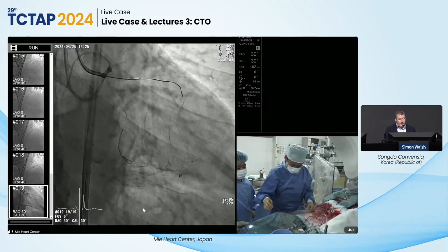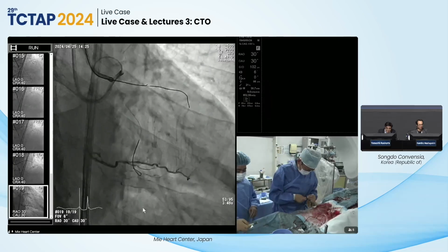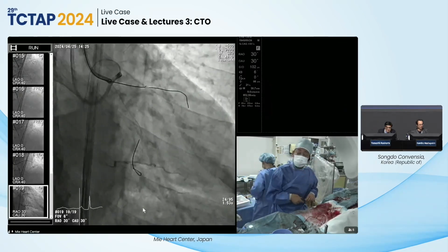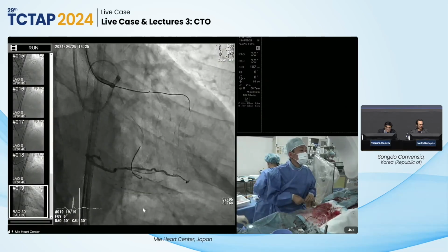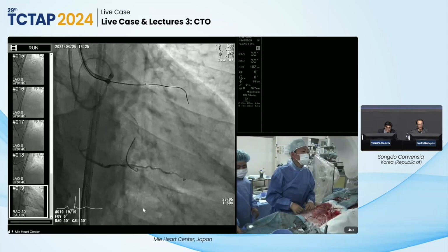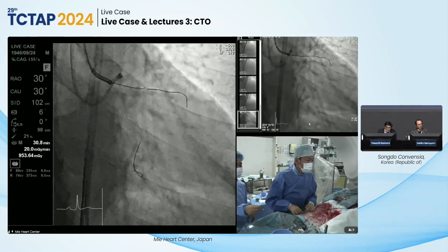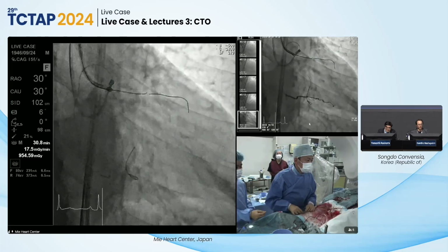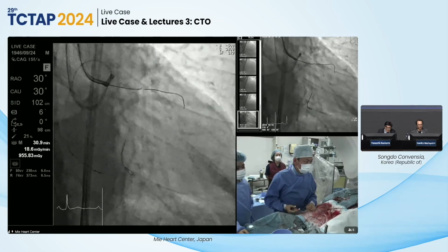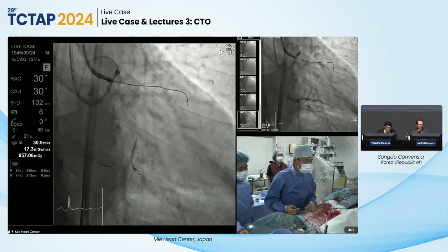Yeah, I mean, here we have some great septal options, probably the safest opportunity to get the retrograde wire down. And the conus branch doesn't help a lot because here it's ending up at the distal cap, so you can only get a wire down distally as a marker wire. Therefore, it's absolutely reasonable, in terms of risk and also for the CTO procedure, to get this septal collateral wired.